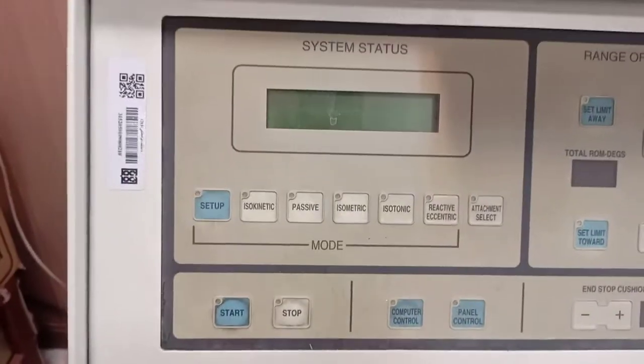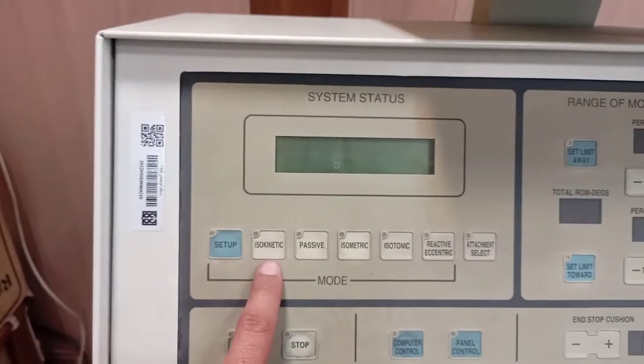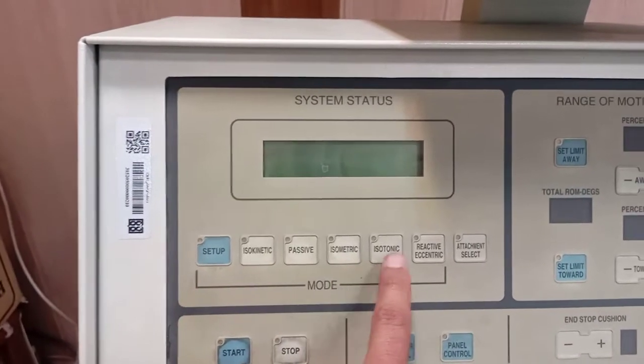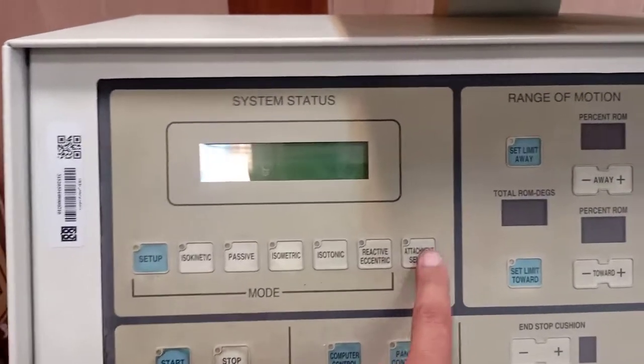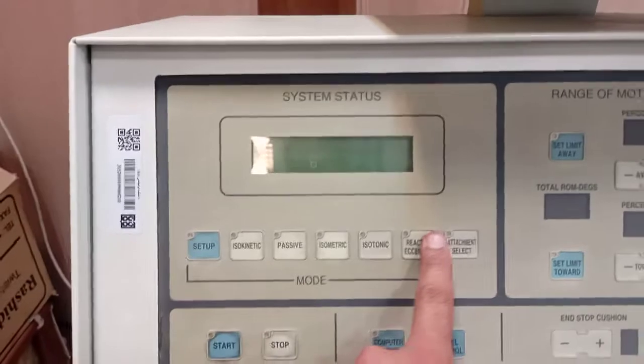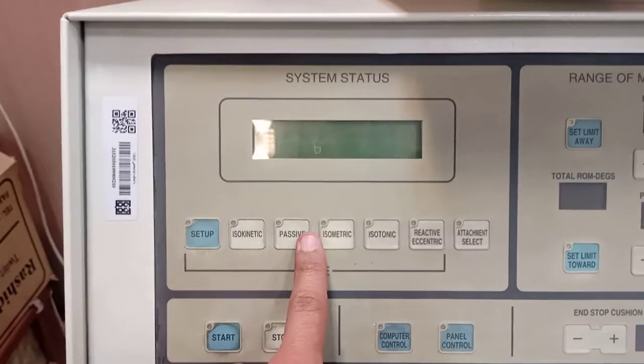For example, if we discuss the system status or the mode, we can set up for isokinetic, passive, isometric, isotonic, reactive, or eccentric — and attachment selection for all these modes. This is for the attachment selection, and these are the modes that we can select from.